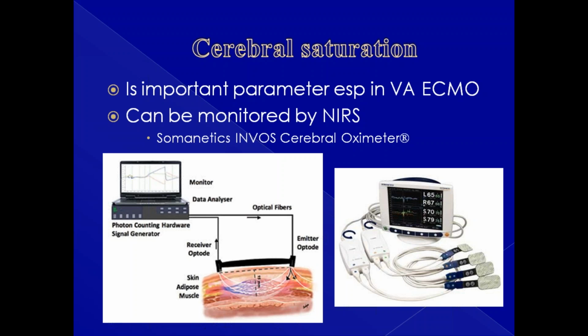Generally what we tend to do is keep a couple of probes, one over the cerebrum or scalp and another probe over the kidneys. So we are measuring both somatic saturations as well as cerebral saturations. In general, you would expect your cerebral saturations to be 70% of the systemic saturations. That is the measure. So it's a non-invasive way of measuring oxygen saturation of the tissues underneath. It looks like this, as you have seen: this is the monitor and these are the probes over there, non-invasive probes.